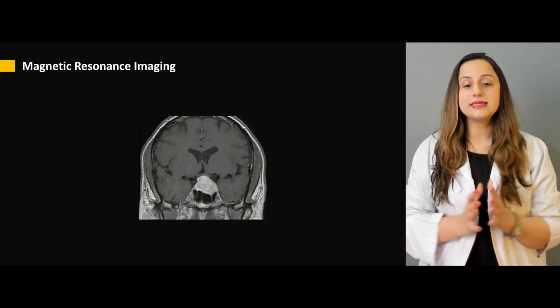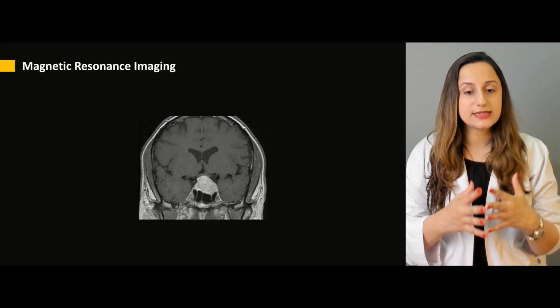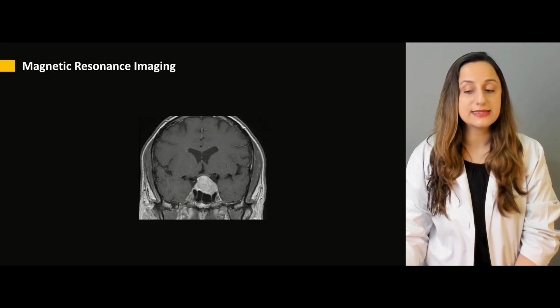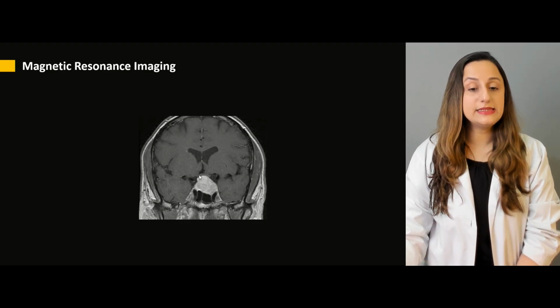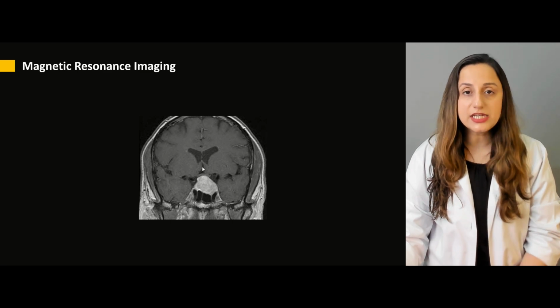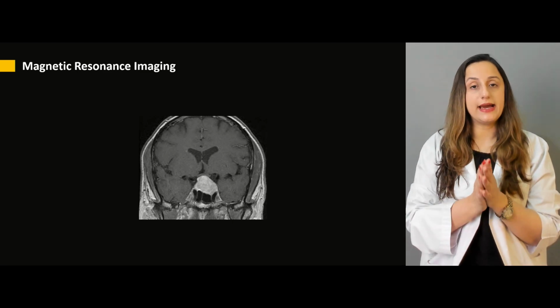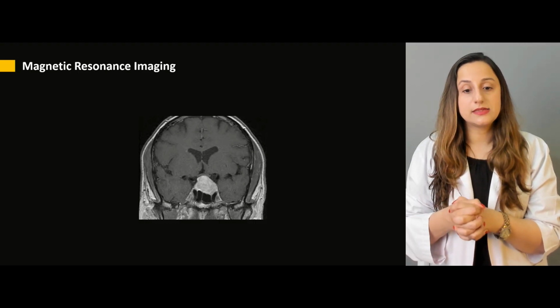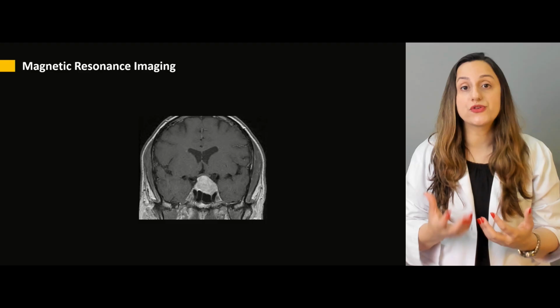Now, looking at these CT scans and MRIs, just having a normal look, we just have to look at the spaces over here. And we would be basically featuring the infundibular stalk over here. Now, the deviation of the infundibular stalk has to be seen. If there is a mass deviation, it's basically going to be a contralateral deviation.